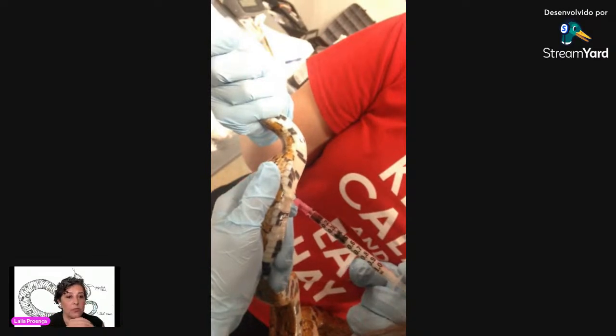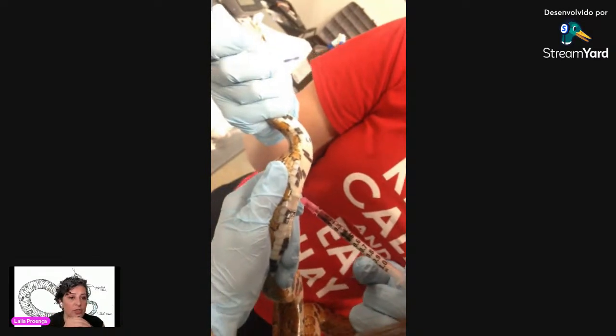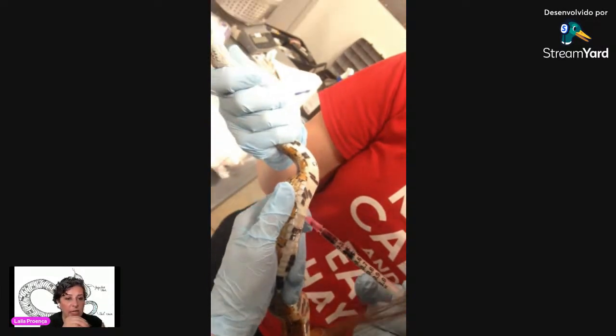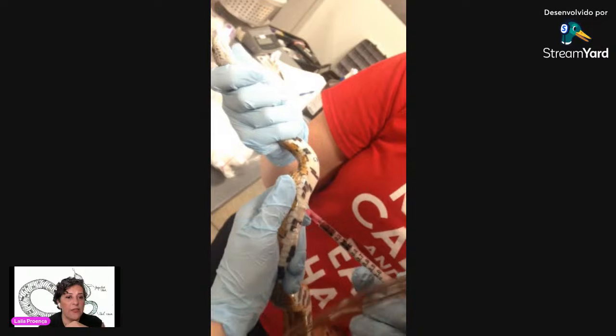If you want to stabilize the reptile, you're going to have to use the same technique. If you want to use ultrasound, just like if you were collecting from the bladder, you're always going to use the same angle. Then you can definitely do that. I definitely recommend doing that, because it's going to help you, especially if you don't have experience. That's going to be really, really helpful.